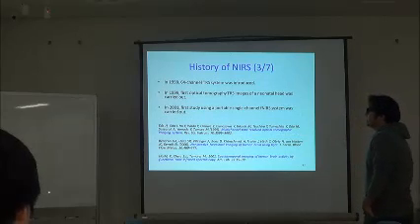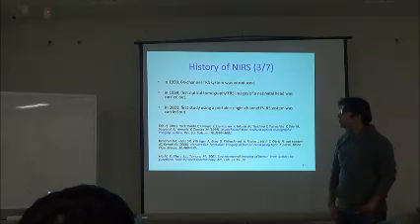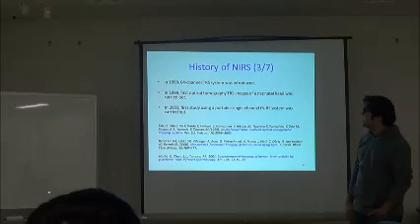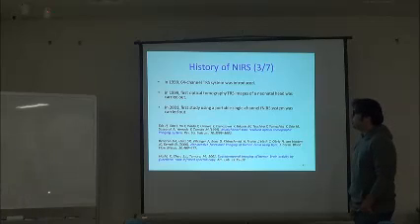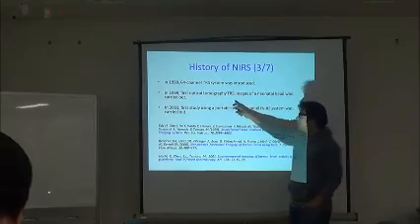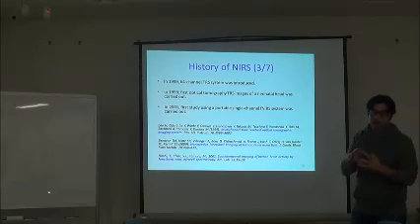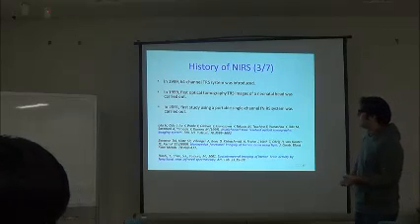Well, after that, in 1999, 64-channel time-resolved spectroscopy equipment was introduced. So this was the first 64-channel time-resolved spectroscopy (TRS) system, and of course in '99 the first optical tomography images in neonatology were carried out. So using TRS imaging, they basically provided optical tomography, optical imaging of the structure of an infant's head in 1999 using the TRS system.